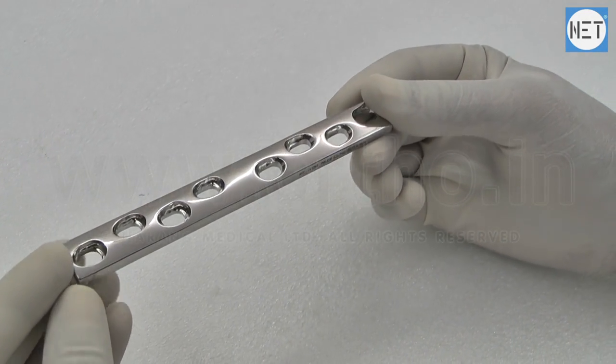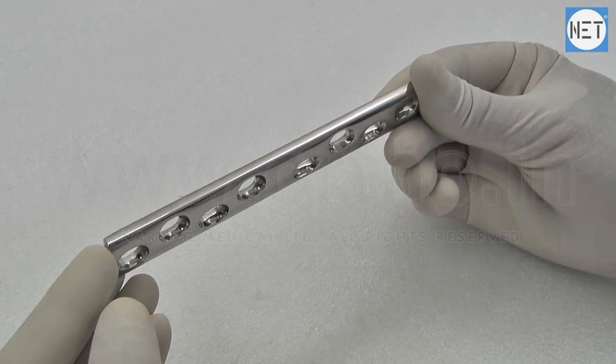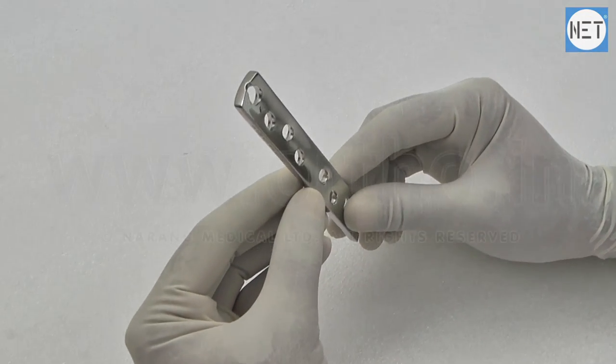The oval shaped hole creates dynamic pressure between the fractured bone fragments. Low contact plate design reduces the plate and bone contact, which reduces vascular trauma.